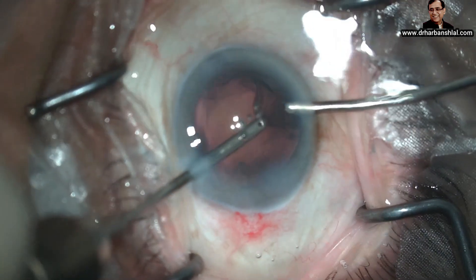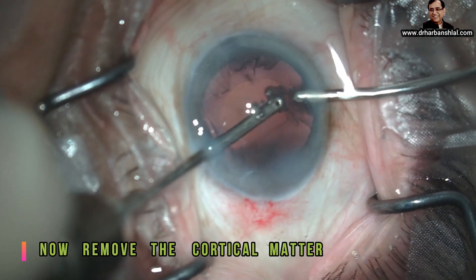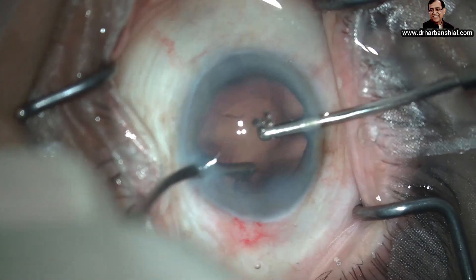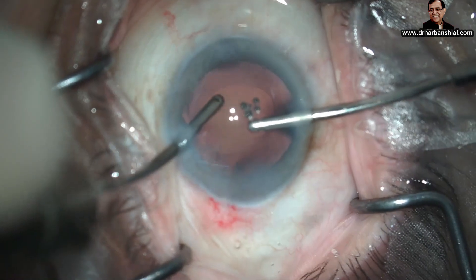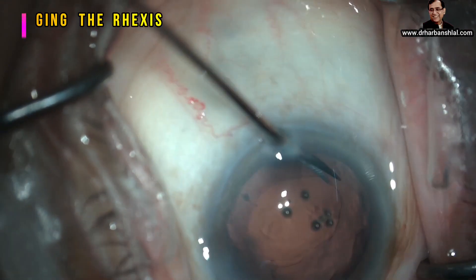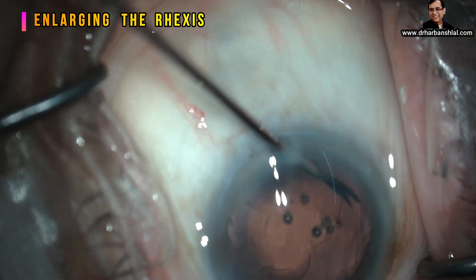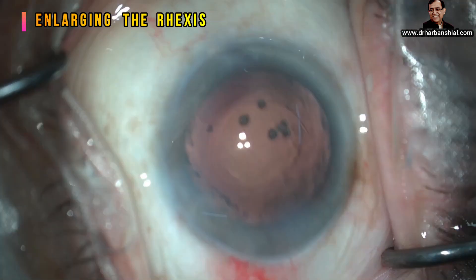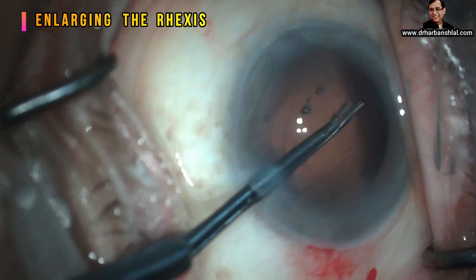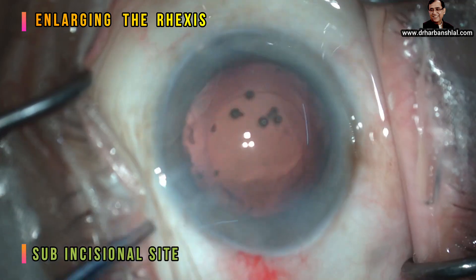After epinuclear plate removal, we are more confident to remove the cortical matter with bimanual irrigation and aspiration technique, as in this case the hyaloid face is undisturbed. The rhexis is small — in mature cataract it was intentionally made smaller as it tends to run away. Now we will enlarge the rhexis with utrata forceps and any sub-incisional technique.